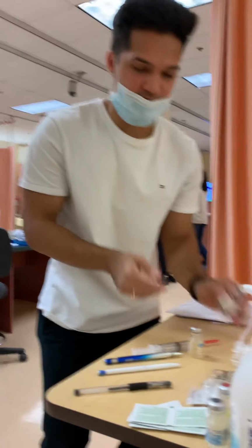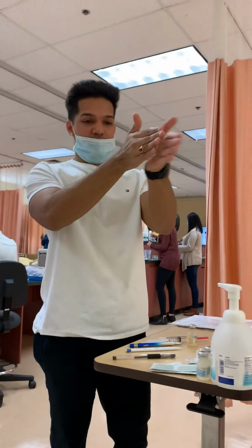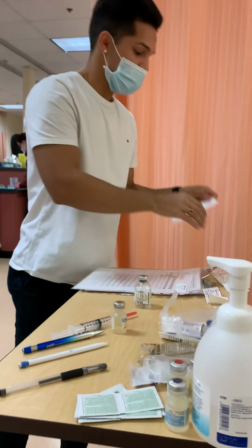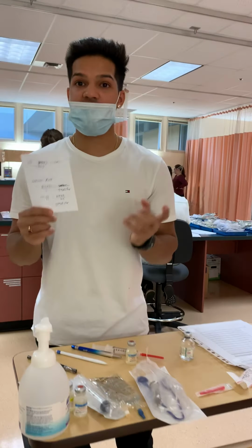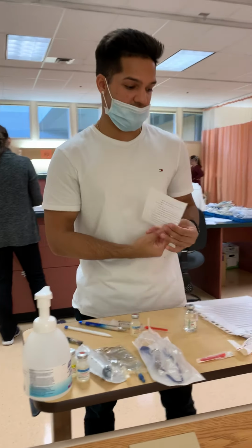Then I'm going to be reconstituting my medication within my hands, making sure there's no sediment or anything in my vial. Once I know it's fully reconstituted, I'm going to calculate my dose. Since I need 1 gram, and the final concentration is 250 milligrams per mL, I'll be needing 4 mL from this medication vial, and that is half the dose in this vial.